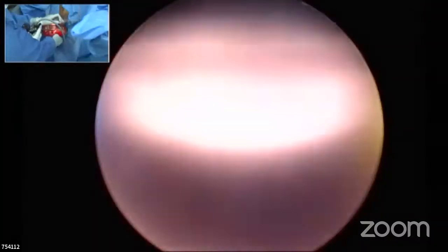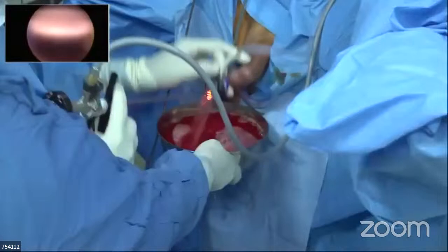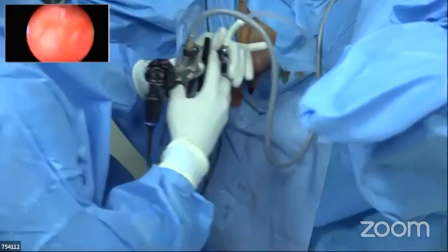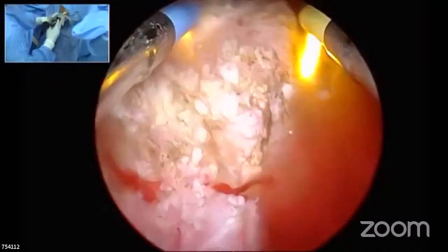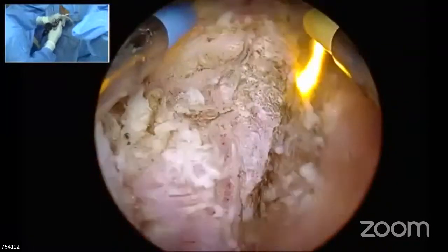So with the half loop, what you are saying is that when you are cutting, you can see the other half of the loop, and so judge the depth you are cutting. Sir, for the experienced surgeon, you know the loop depth is about 3 to 4 millimeter, and you know how deep you want to cut. So whether you see the loop or don't see the loop, it's not going to make much difference.